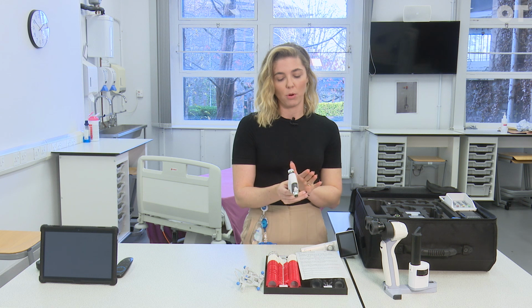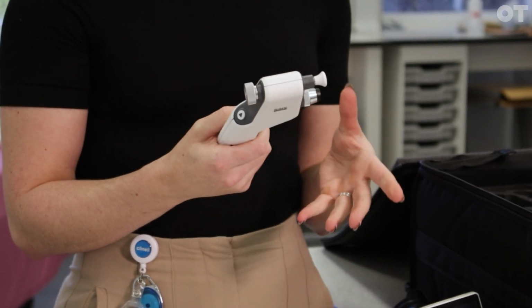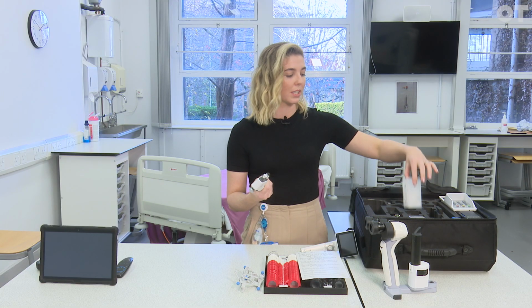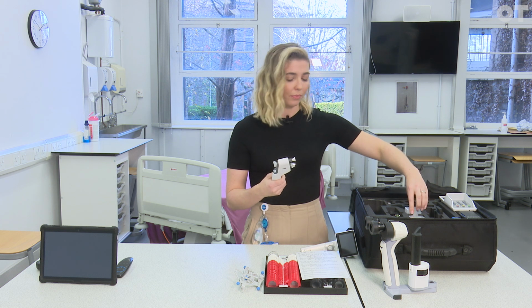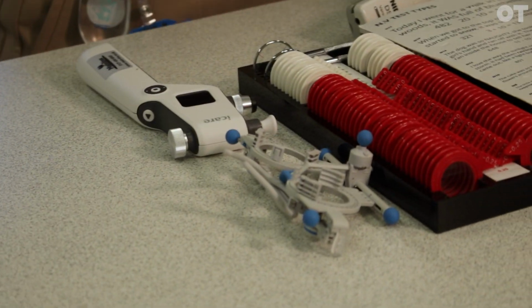We've got a tonometer, so we use an iCare. It's a lot lighter, it's more portable, it's a lot more comfortable for our patients. You don't have to use any drops, so you're not having to carry anything extra around with you. You're obviously just using your probes and taking them as and when. It's a lot easier for patients when they're lying down and it's just much nicer to use.